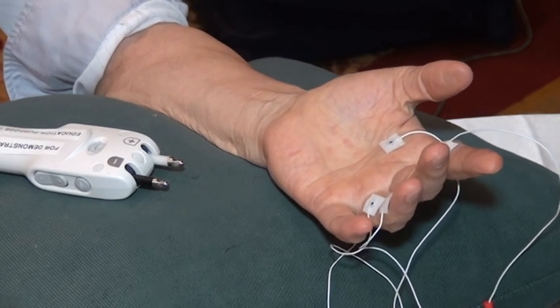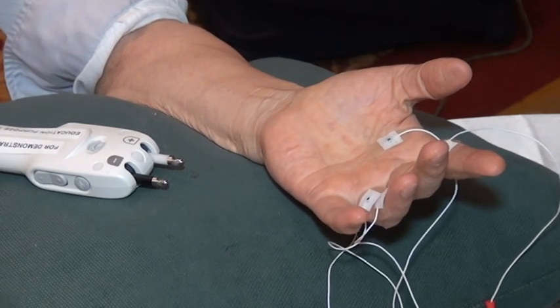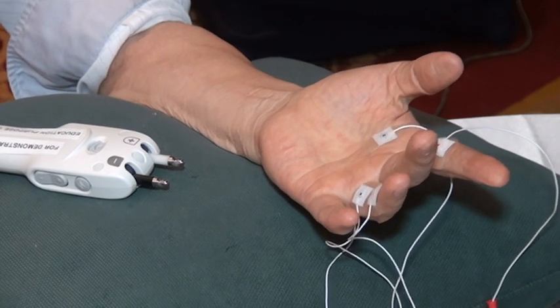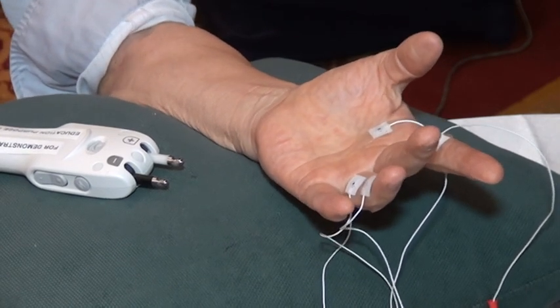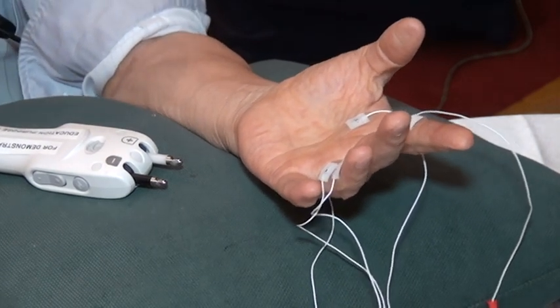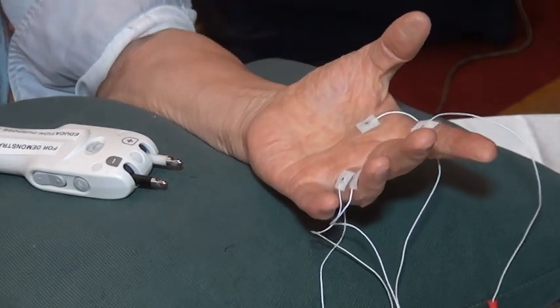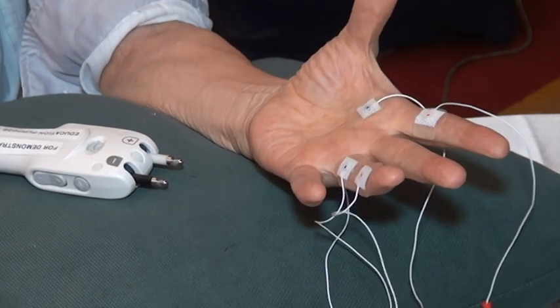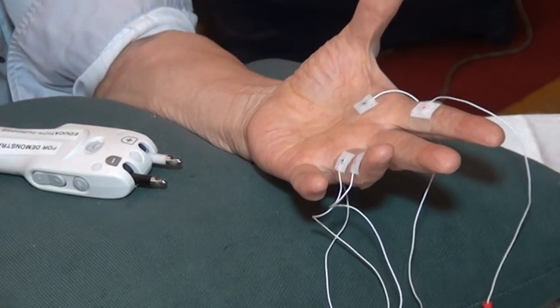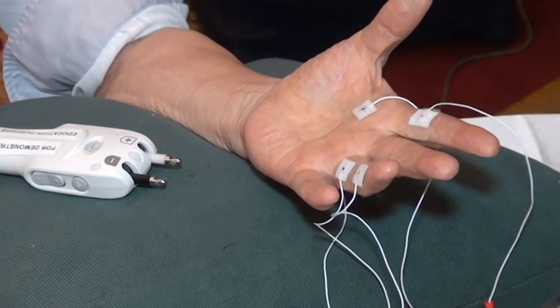0.8? 0.4. Right, 0.4 every 2 centimeters. Every time you move 2 centimeters, that's 0.4. Every time you move 1 centimeter, how much? This number you're going to remember. When you move 1 centimeter, 0.2, right? Because nerve conducts at 50 meters per second.